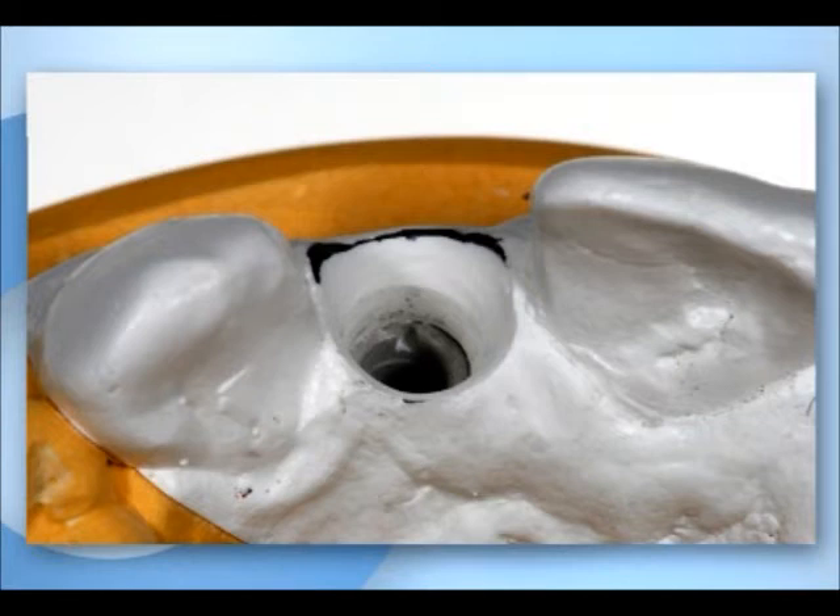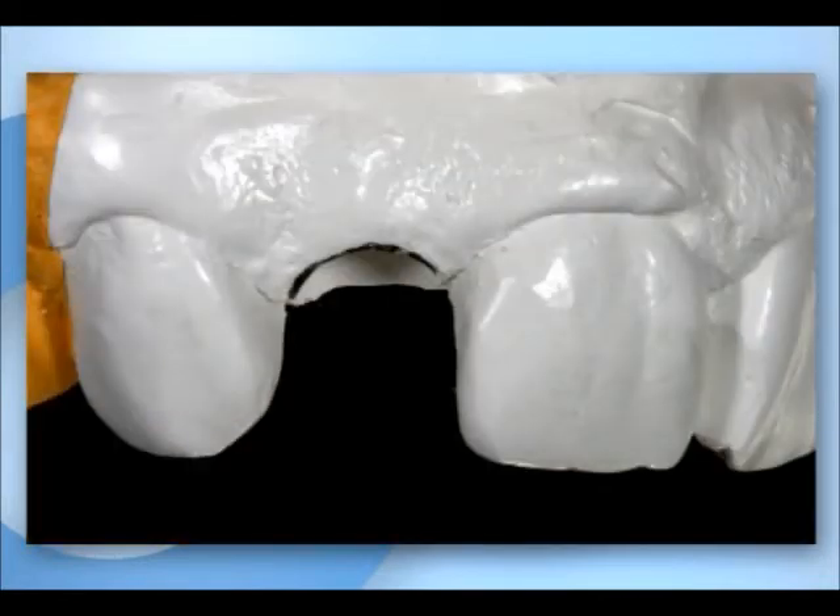The technician works in close cooperation with the clinician. When the gingival mask has its final dimensions, it is ready to support the fabrication of an implant crown.